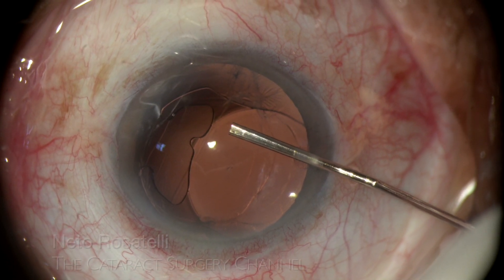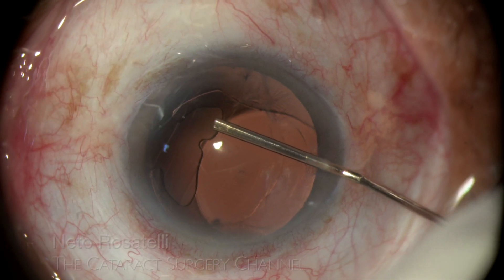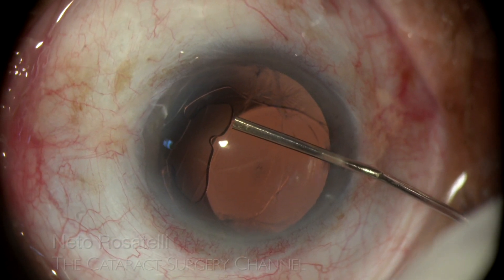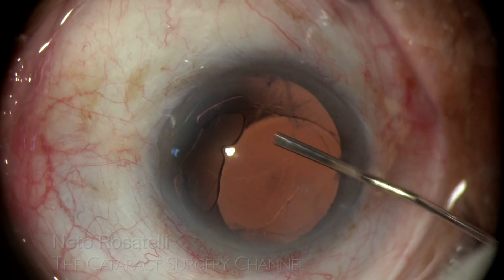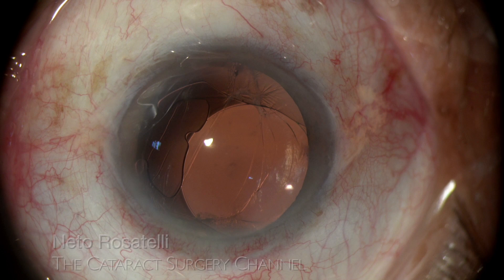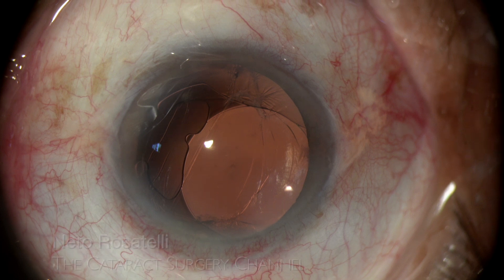The patient is under peribulbar block and intracameral 0.5% lidocaine is injected to ensure good anesthesia. I can immediately notice that there seems to be no vitreous in the anterior chamber, a very good sign indicating that the anterior hyaloid may not be ruptured.